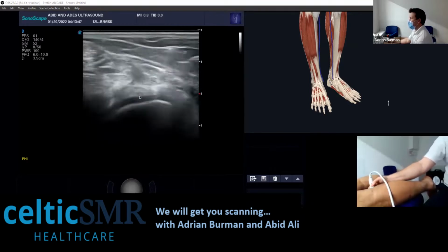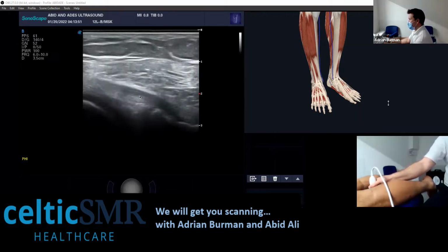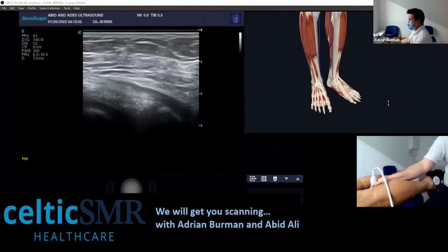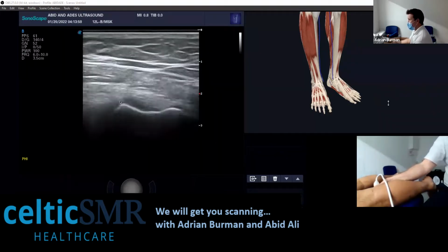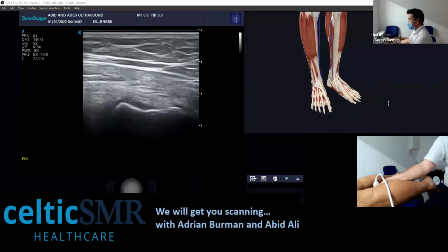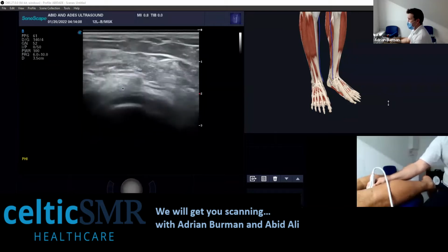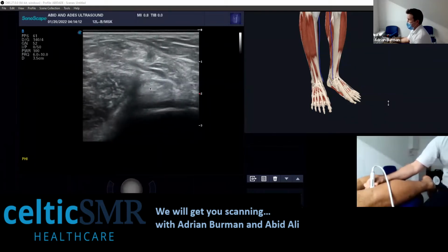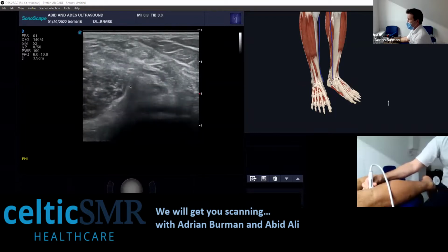So interestingly, if I come down now to the joint, so I'm on the medial aspect of the joint. So this tendon here, this is the semimembranosus tendon. So if I curl that now to the medial tibia, you can see that's the semimembranosus tendon. So it's a nice way of interrogating that. I go transverse. There's your landmark for your Baker's cyst, semimembranosus tendon, and there's your potential space for the Baker's cyst.